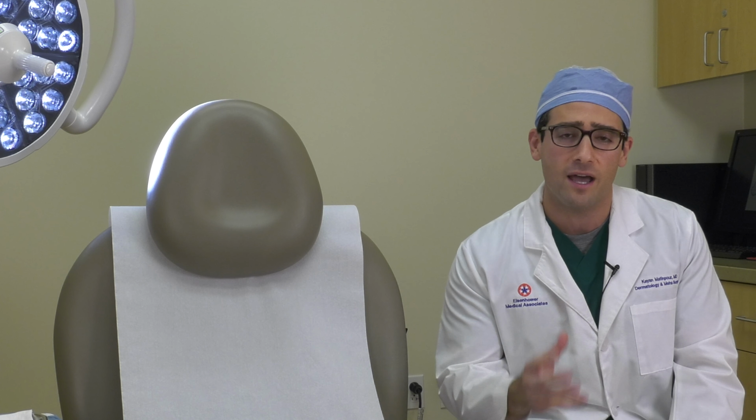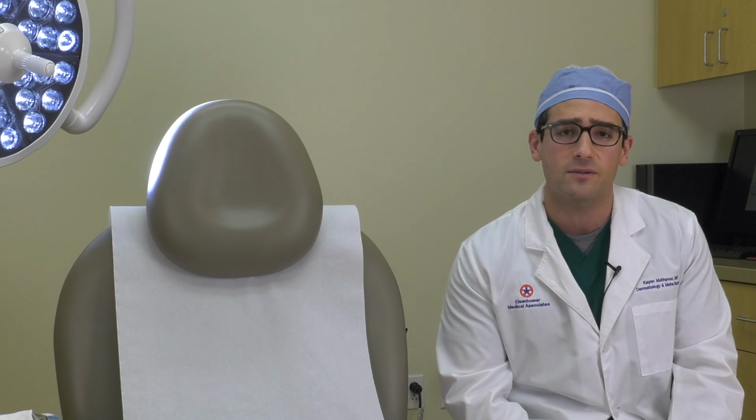The first piece of equipment is the Visiomed device. It's a digital dermatoscope. A dermatoscope is what dermatologists use almost like a stethoscope. On every single patient, we have a handheld device. It's a magnified lens with a polarized light attached to it, and it allows us to see structures on top of the skin that you can't see with your naked eye.